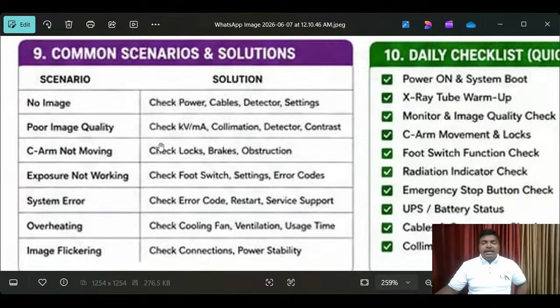Okay, sometimes what happens is a locking problem, sometimes stacking will happen, otherwise the inside locking system will be damaged. Everything you have to find out. If it is needed, immediately inform the management of the requirement. Okay, if you have a spare, then immediately try to replace it.